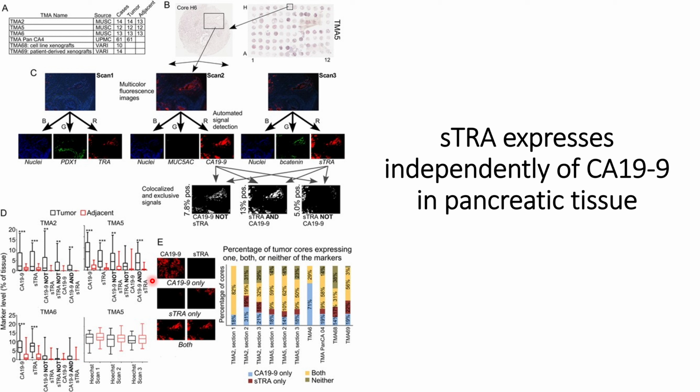The differences across the tissue microarrays are due to different expression in the pancreatic tissues, because of the inherent different mutations in the patients.